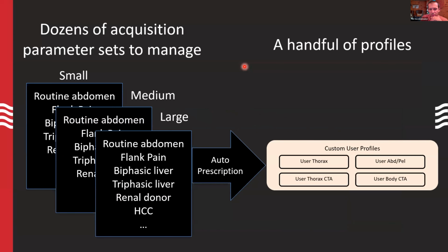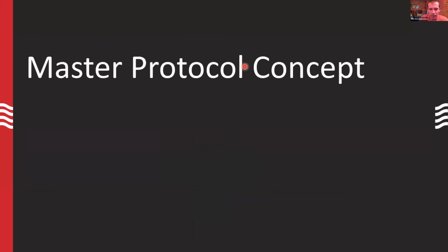So this does also facilitate, depending on the vendor, setting up typical profiles, if you will, or ways you want to do it. In other words, pitches you want across patient size, and then use those in multiple places. This is one vendor's implementation. There are other ones I like, and there are pros and cons to all of these different solutions, but they all get us to the same place. Other vendors might let you pick a profile that's going to change some of the pitch and rotation time things for you without you having to preset them up or think about it. So there are other solutions out there.